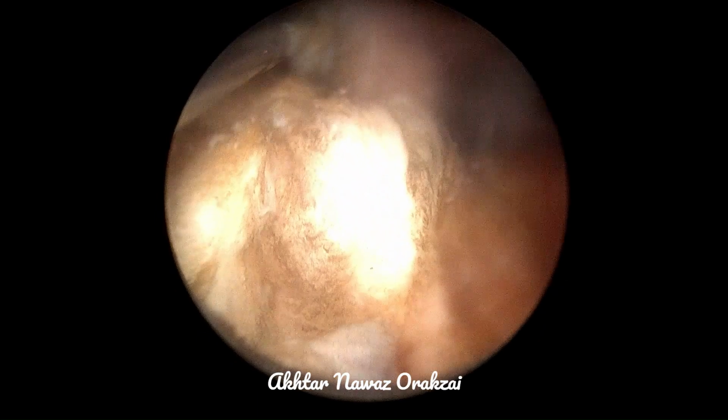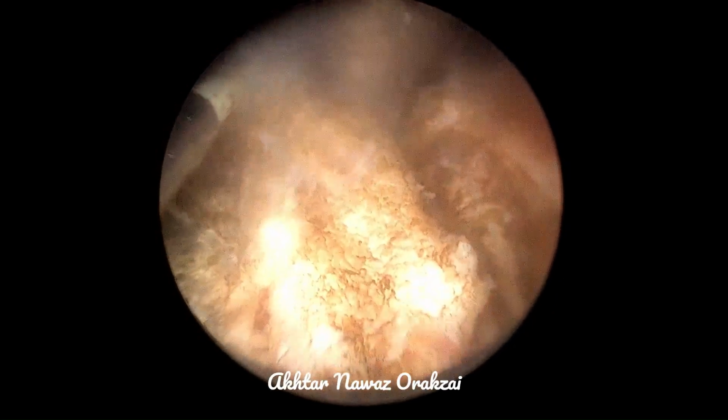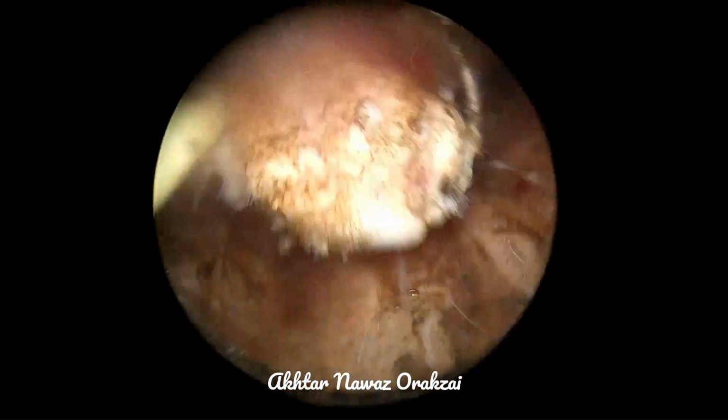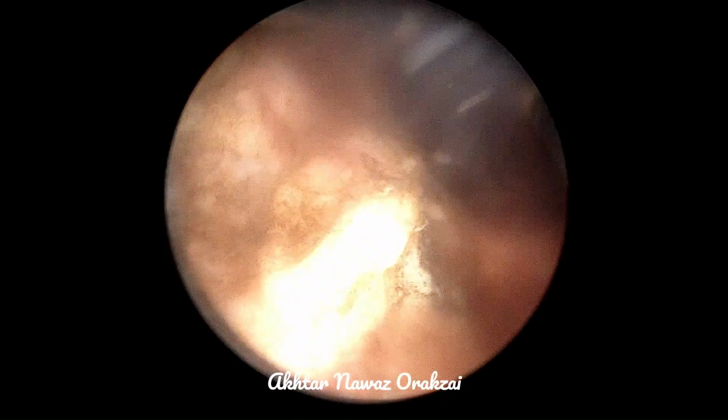So now you can see that after resecting the left and the right lateral lobe, more of the median lobe has popped up. So now we can easily resect that portion.